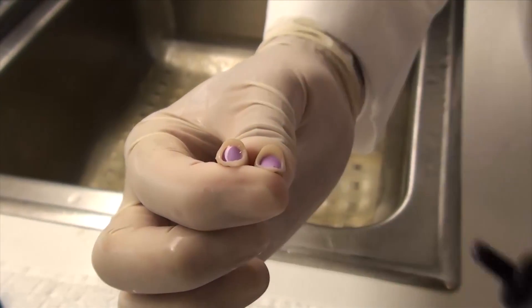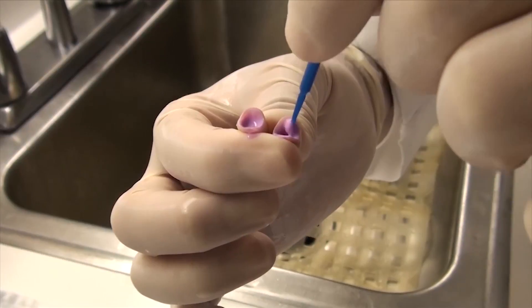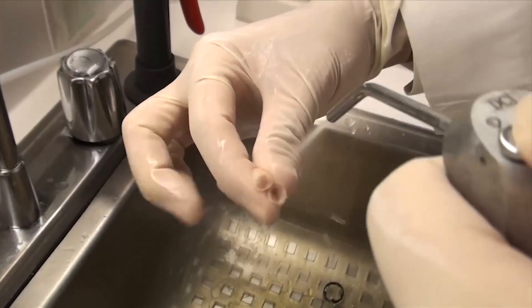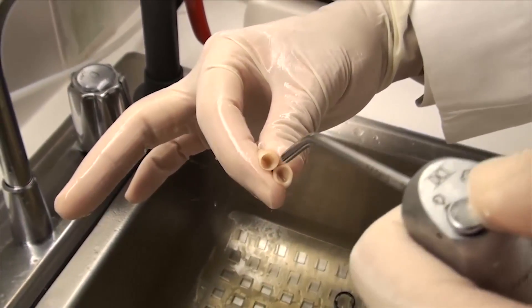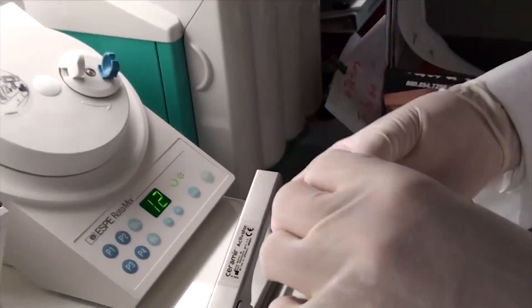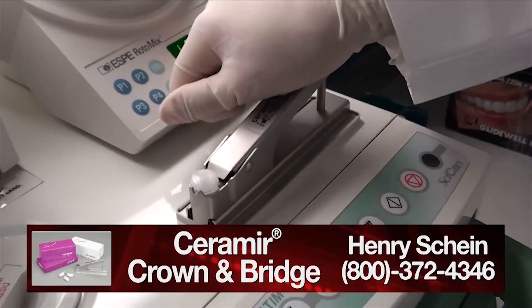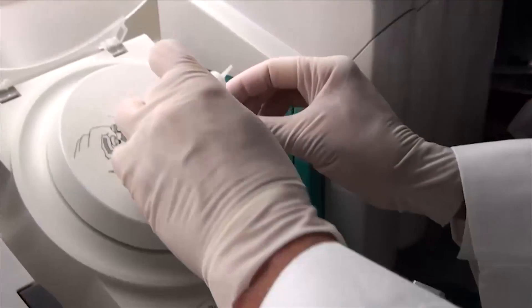So I could either sandblast them, or — what I'm doing in this case because I'm too lazy to walk down the hall to sandblast them — use some Ivoclean from Ivoclar. This 12-to-15% zirconia oxide solution, just spreading it around the inside of all those crowns, is going to remove all those salivary phosphates from the inside of the crown and allow us to place these crowns without worrying about it. If we're going to put these in with a resin cement, we would apply Z-Prime Plus and then a resin cement — but we're not.